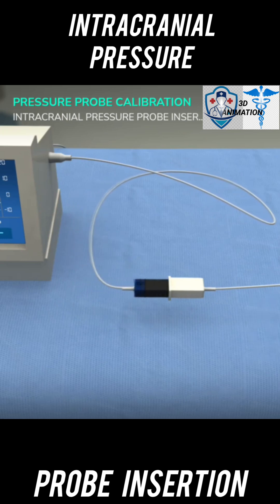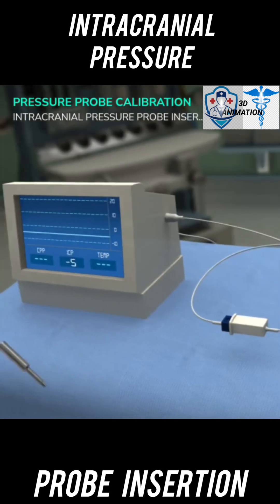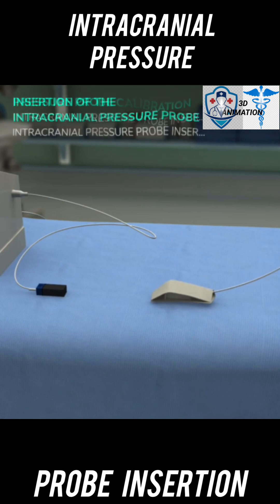Connect the fiber optic probe to the preamp connector of the monitor. Ensure sterility of the probe by having the assistant hold the end of the preamp cable. Use the screwdriver to calibrate the system to zero. Ensure the probe is not in contact with any item during calibration. Store the contaminated connection site of the fiber optic probe out of the sterile field, and ensure the probe itself does not become contaminated.